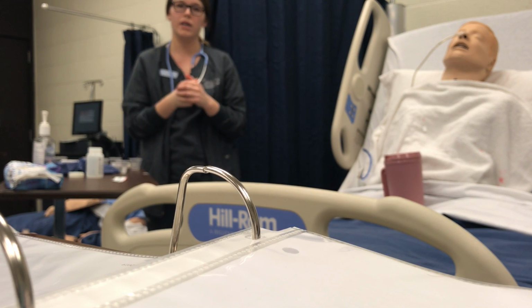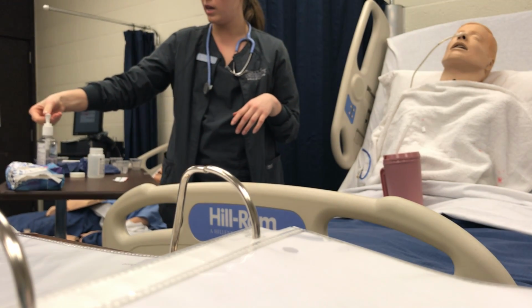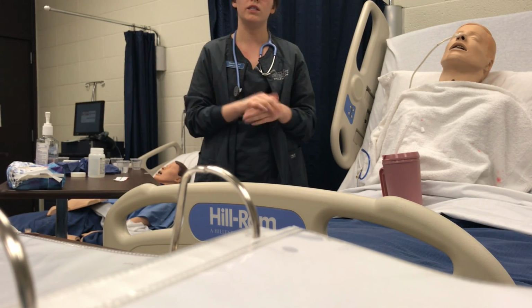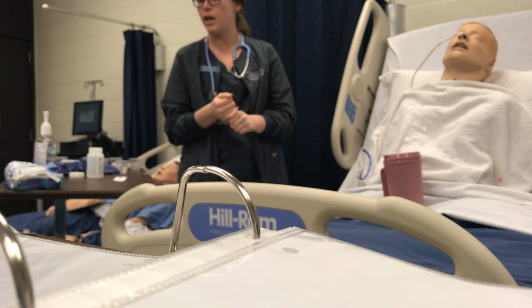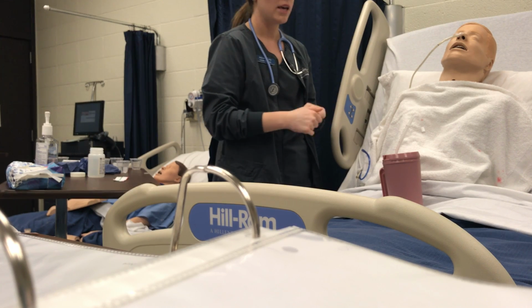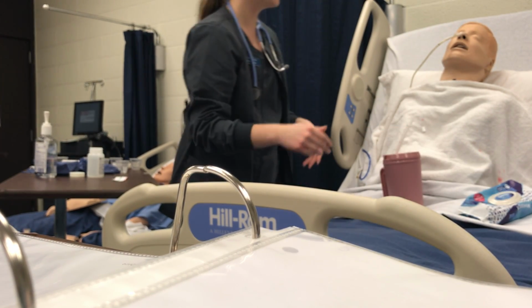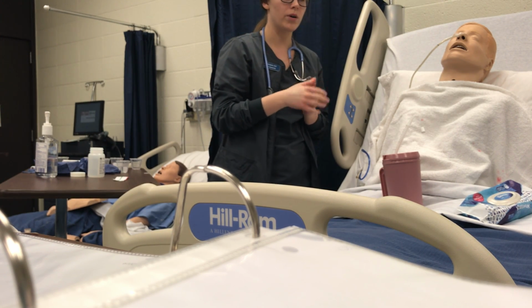I would come back in to remove the tubing. So we're going to do that now. I would wash my hands, perform hand hygiene. I would make sure that I had an order to take the NG tube back out. And I would also let the patient know that I'm taking it out. So we're going to go ahead and take your NG tube out, okay? And so I'm going to place some Kleenexes here by you in case you want to clean your nose off and your mouth off when it's coming out. We'll go ahead and do that.